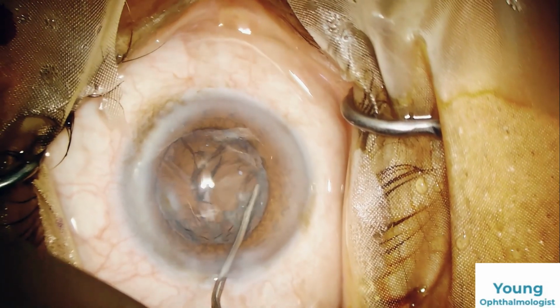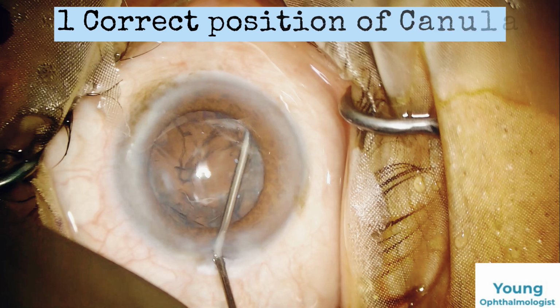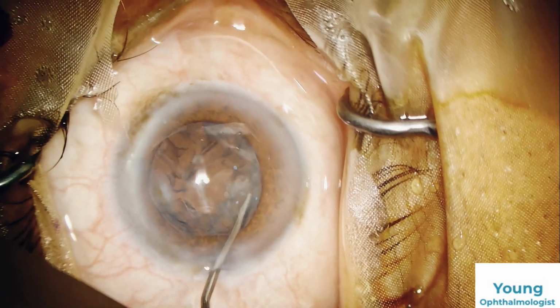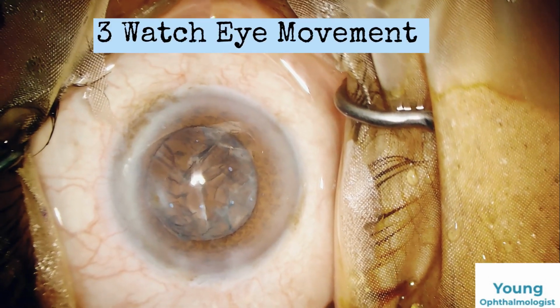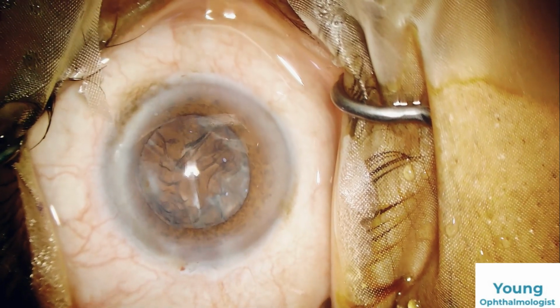Here you have to take care of a few things. First, the cannula should be positioned between the capsule and the epinucleus to avoid any push of the saline through the zonules. Second, the push should be very slow. You should not push very hard. There is a chance of hydration of the vitreous. Third, you should take care that sudden movement of the patient's eye can cause damage to the posterior capsule. So these three things you should take care of.